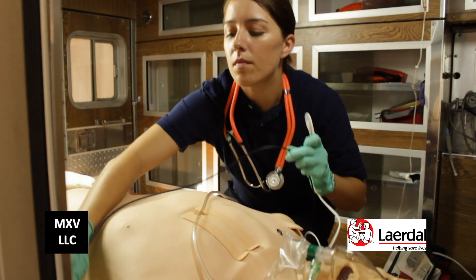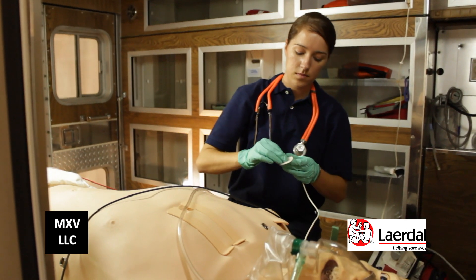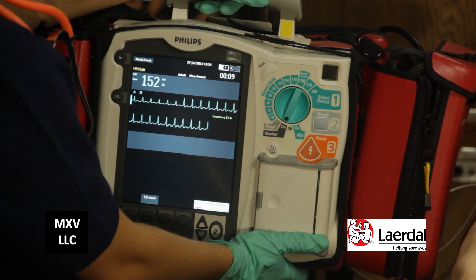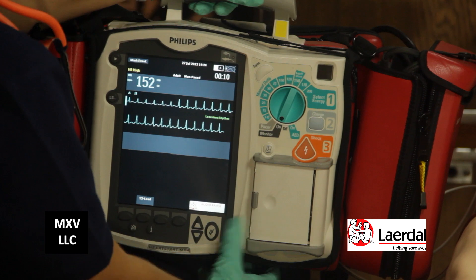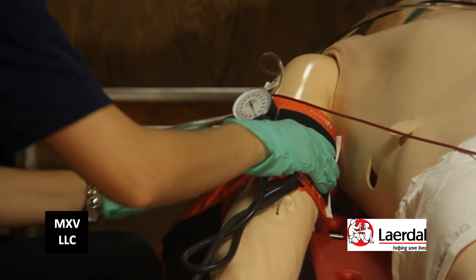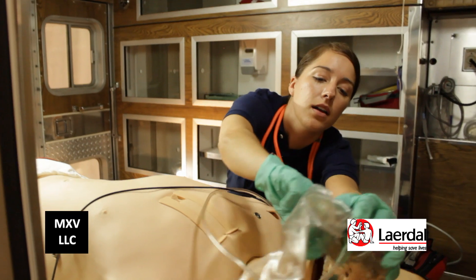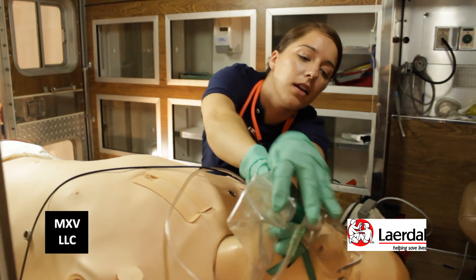A 3-lead EKG is taken, which demonstrates supraventricular tachycardia. While placing a blood pressure cuff, she instructs the patient to bear down or simulate sucking on a straw.